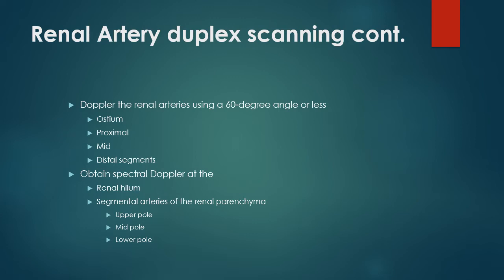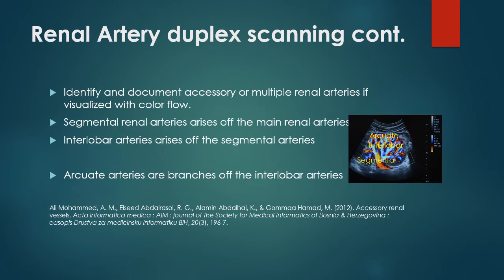Obtain spectral doppler at the renal hilum and the segmental arteries in the upper, mid, and lower poles of the renal parenchyma. Segmental renal arteries arise off the main renal arteries. Interlobar arteries arise off the segmental arteries. And the arcuate arteries are branches of the interlobar arteries. Identify and document accessory or multiple renal arteries if visualized with color flow.